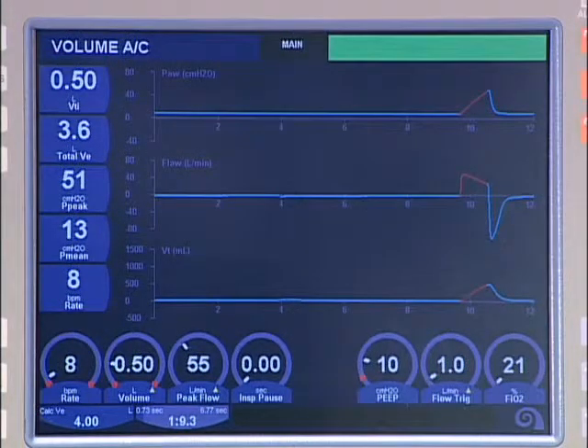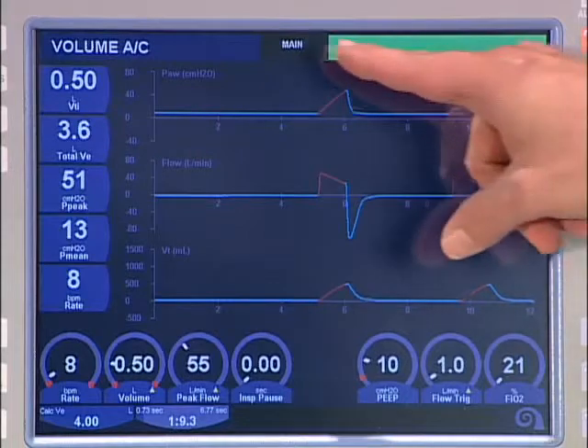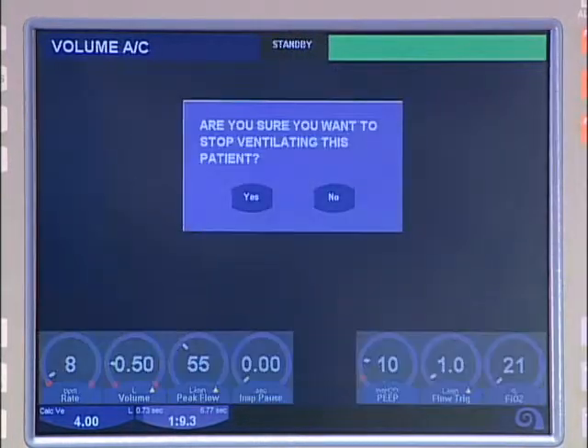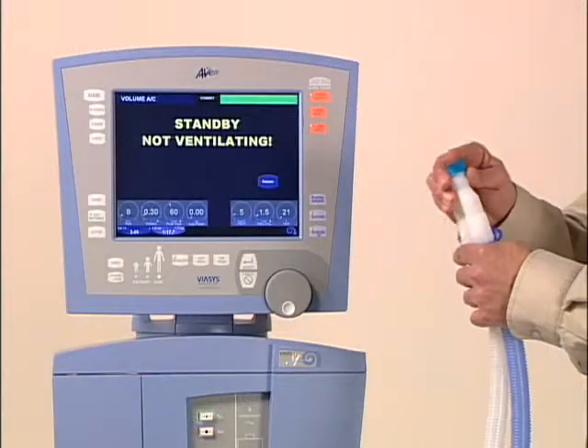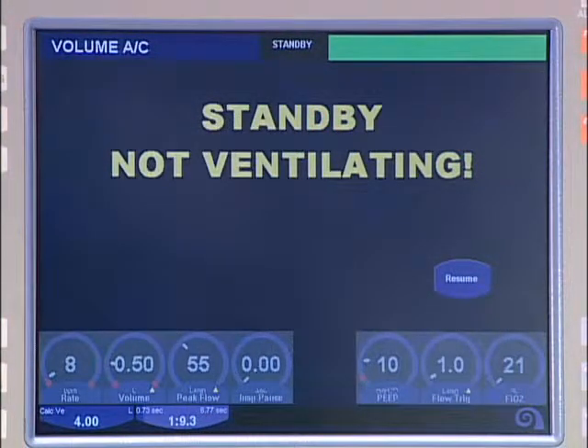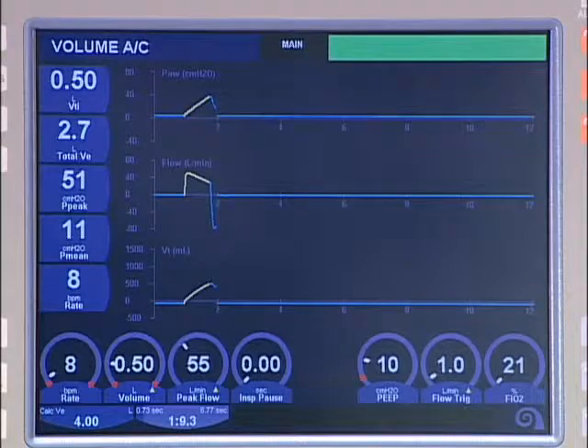The standby screen was developed to provide an easy way to suspend ventilation during times when the patient is away from the ventilator and a quick way to safely restart ventilation once the patient has returned. When standby is selected, the ventilator supplies two liters per minute of gas flow to prevent accidental overheating of the circuit by the heated humidifier. Cap the end of the circuit Y to ensure complete gas flow through the expiratory limb. The text message continuously cautions that the ventilator is not ventilating while in standby mode. Immediate resumption of ventilation at the most recent settings is as simple as the touch of a button.